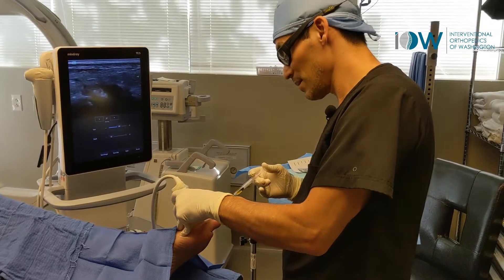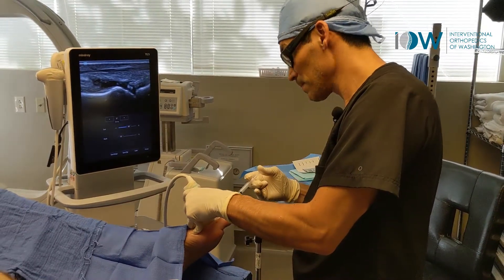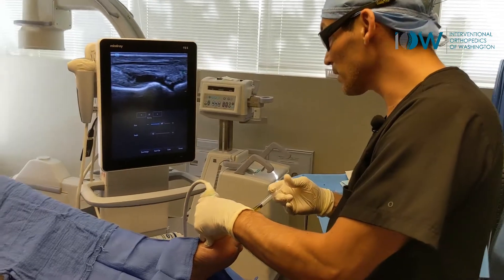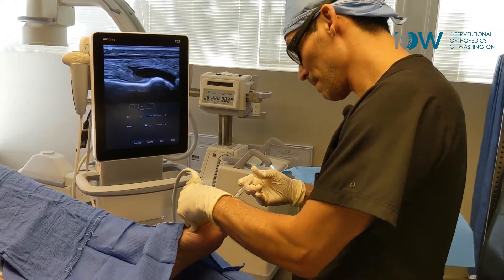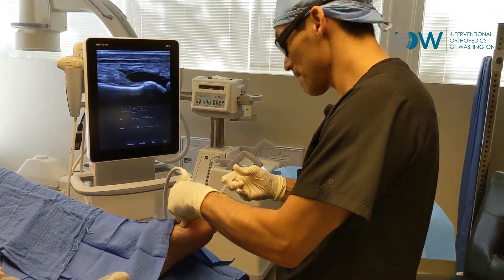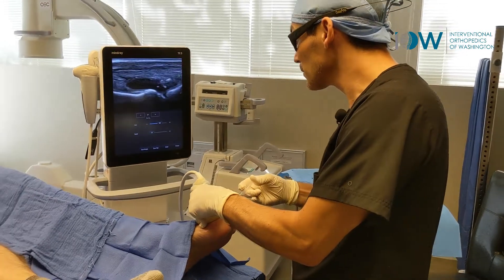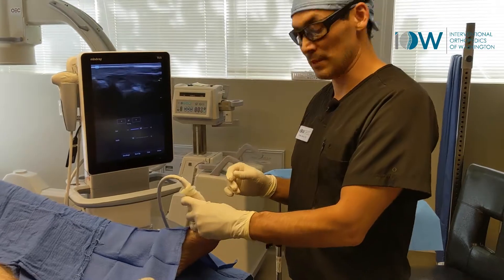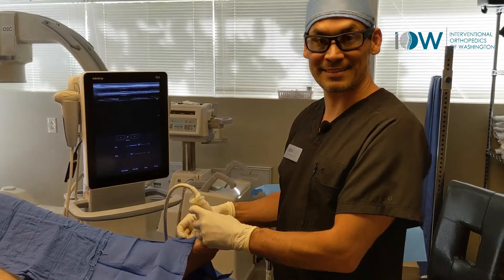How's that feeling? Doing okay? Yeah, all right. We can see all those irregularities, calcifications from chronic dysfunction. And that's how you do a metatarsophalangeal injection.